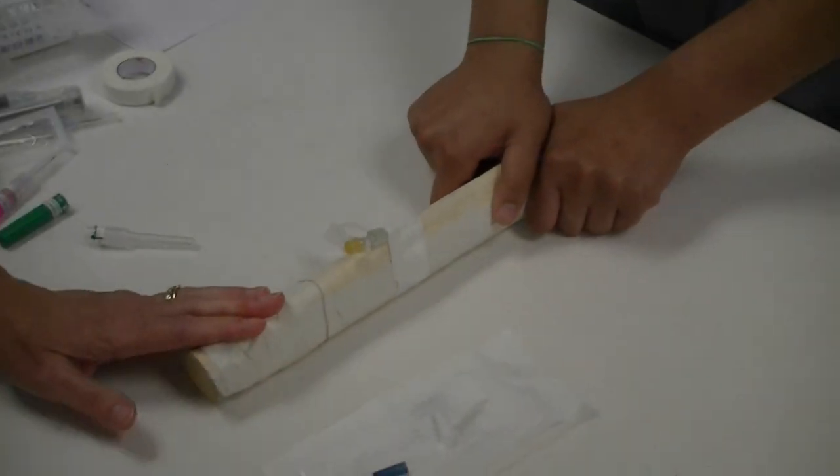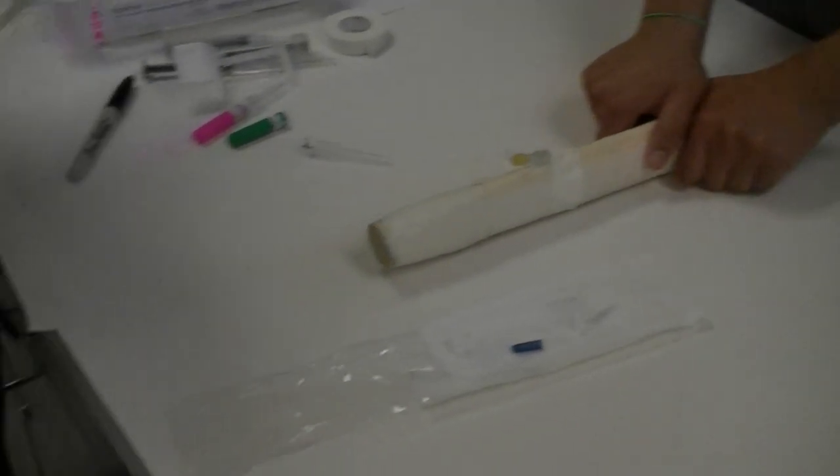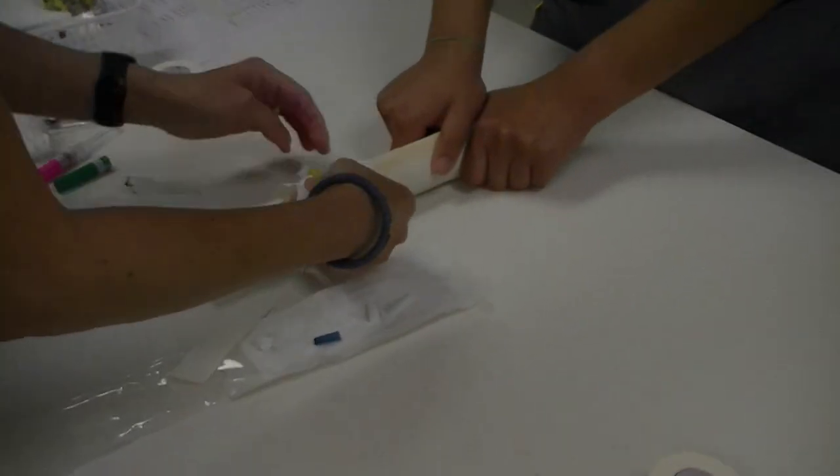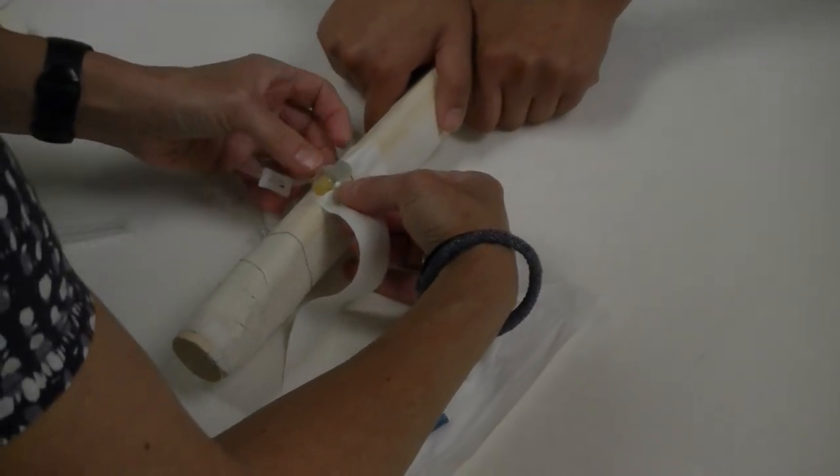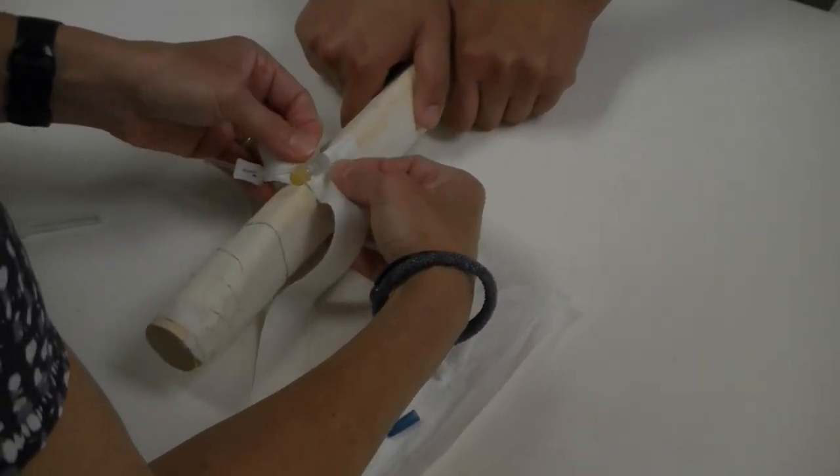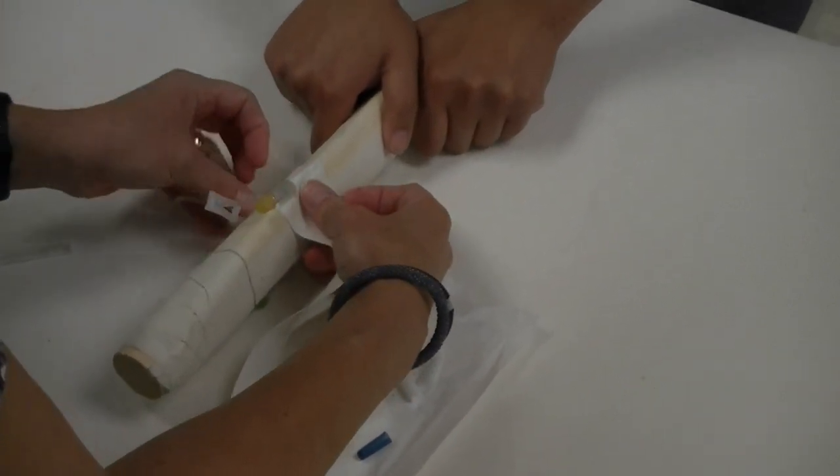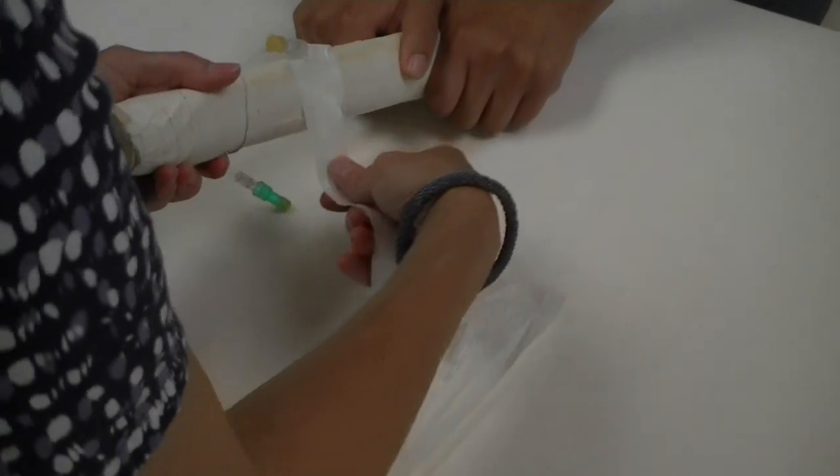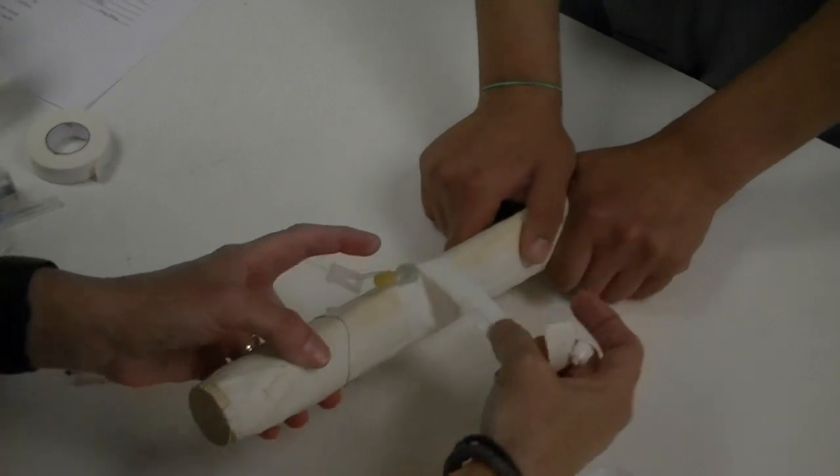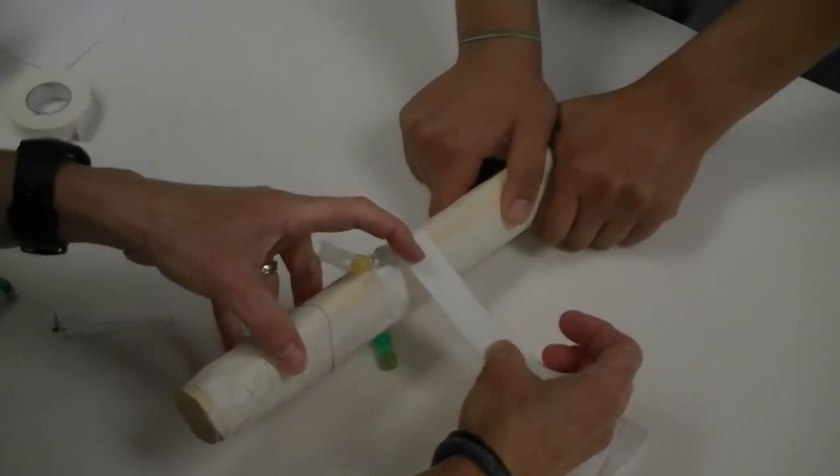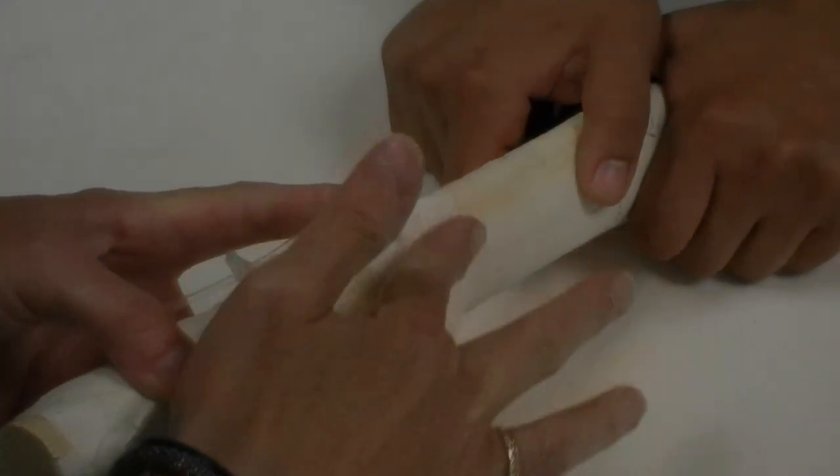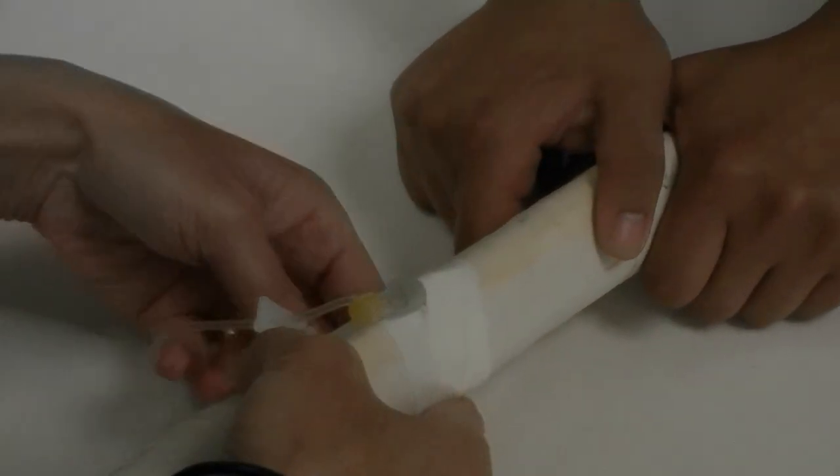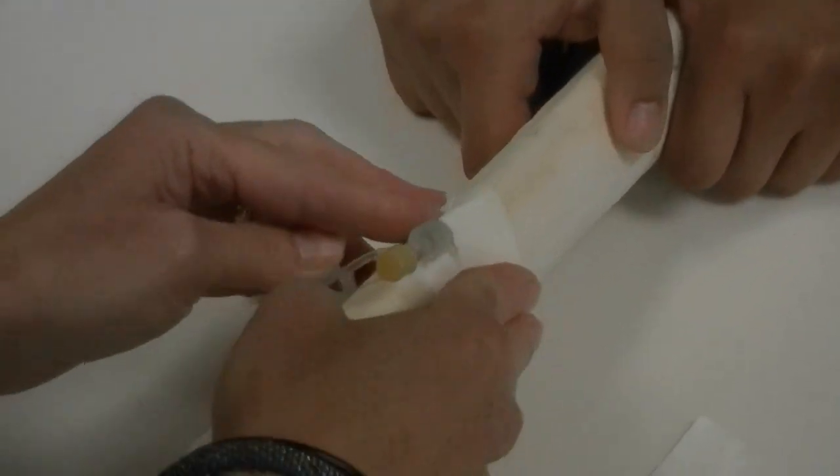Now I'm ready for that second piece of tape that I prepped—that's the one with the split. I'll slide that sticky side down below the catheter hub, stick it to the skin of the patient, and then we'll go up at a slight angle and around. Again, I don't want to be covering up this attachment point here in case I need to make changes to the injection ports. So my catheter is fairly secure now.